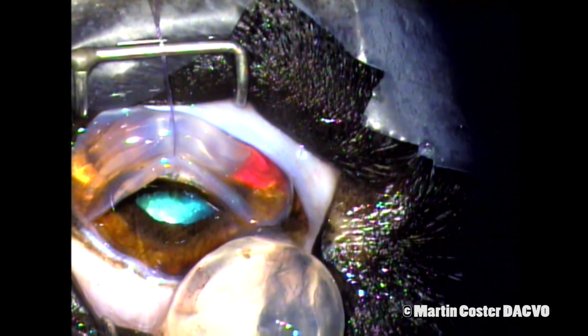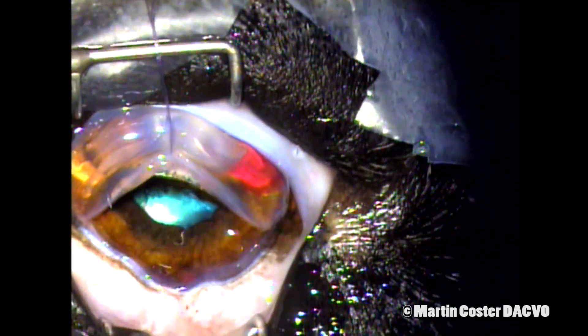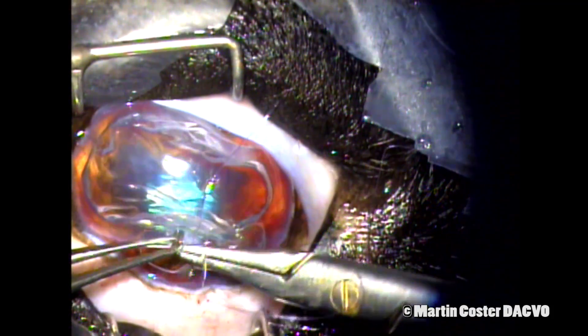We'll take care of the vitreous later on with the vitrectomy. The lens is delivered and removed from the surgical field. You'll see some hemorrhage has occurred during that process that will be dealt with later.